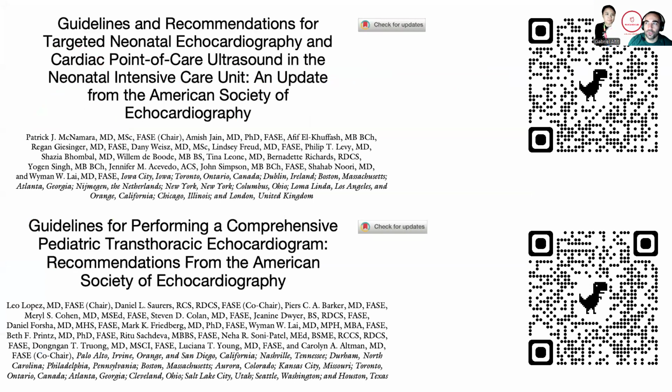I want to remind you that there are guidelines out there, published recently in 2024. If you follow the QR code, you'll reach the website of the American Society of Echo, both for the guidelines on how to perform targeted neonatal echo and cardiac point of care ultrasound in the context of the neonatal intensive care unit, as well as, if you're more within the field of cardiology, some of the information regarding a comprehensive pediatric transthoracic echo in the context of neonatology and pediatrics.